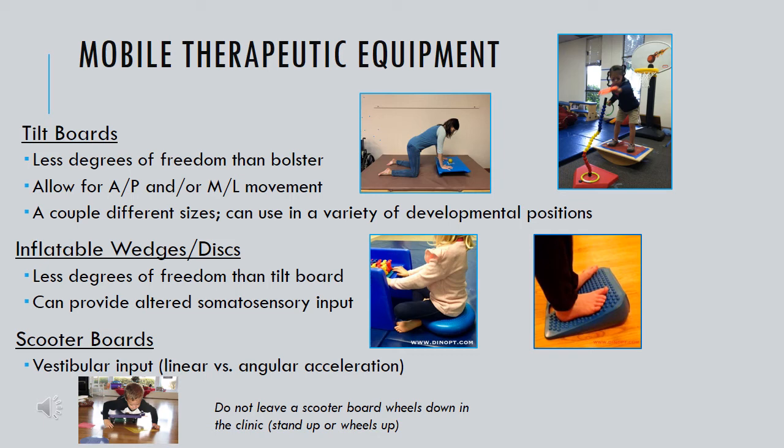It's important to note that when you are done using a scooter board, you either need to stand it up against a surface or you want to flip it so that the wheels are up. It's really dangerous to leave the scooter board down, as we might use it for an actual activity because it does have such mobility.